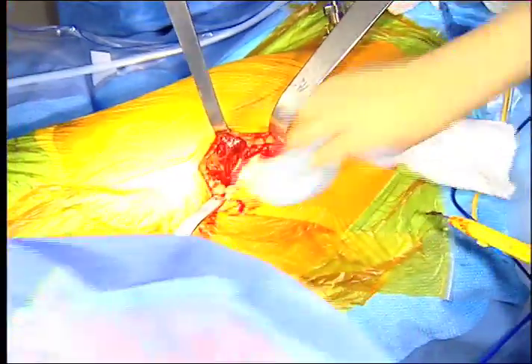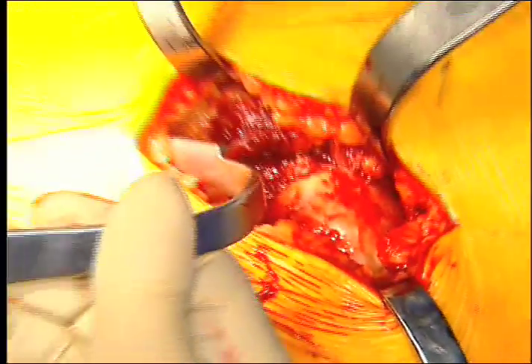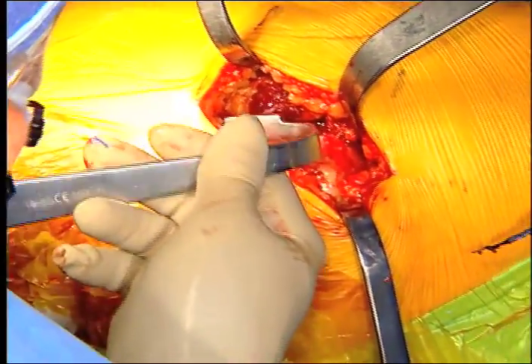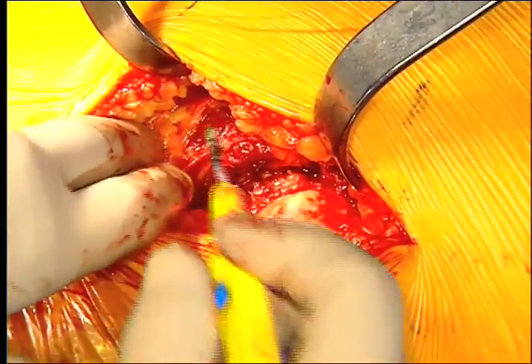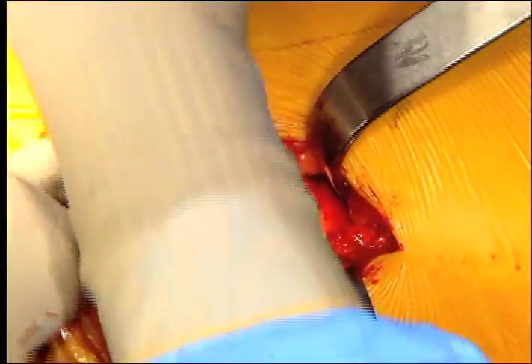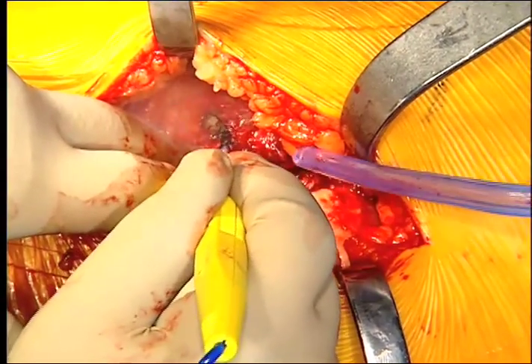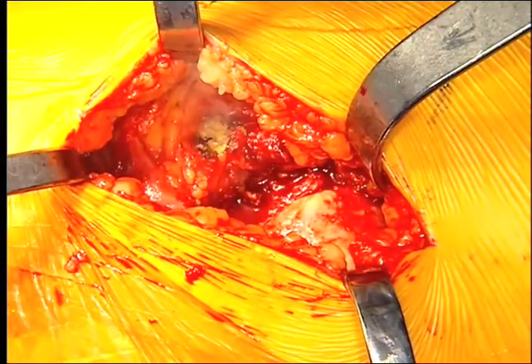Now you can see the neck. I'm going to put a retractor down under the lesser trochanter so I have access to it. Some people like to measure from the lesser trochanter when operating manually. I need it to register the femur into the software for the robot. By palpation, here is the corner of the intertrochanteric ridge and the lesser trochanter — I make a little divot here to put the screw in for registration.